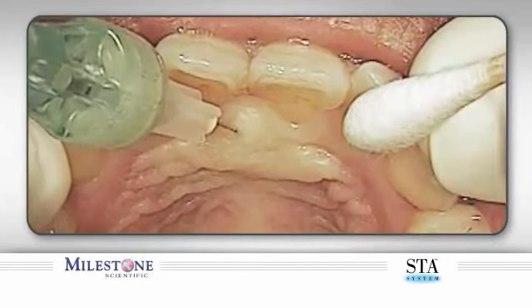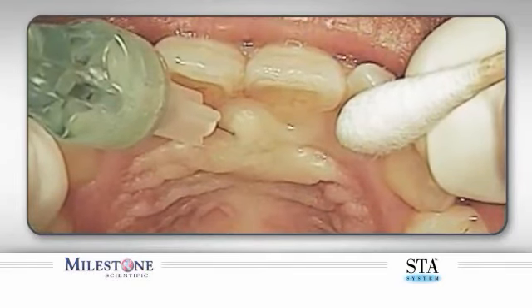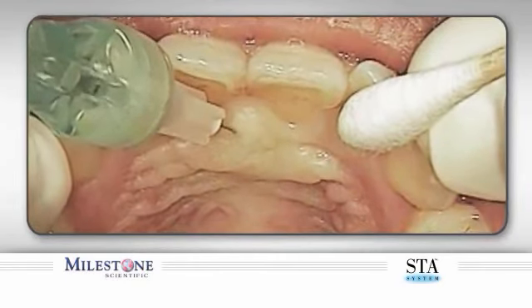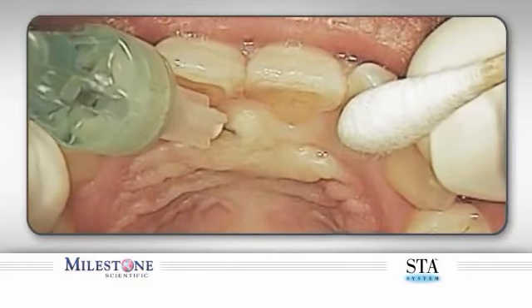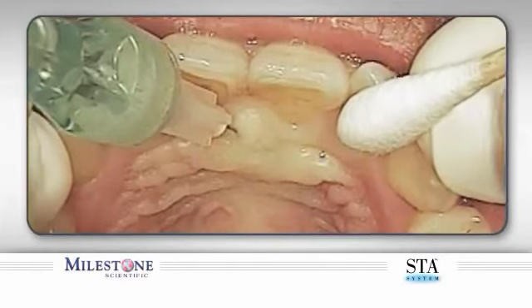If aspiration is negative, maintain position and deliver the proper amount of anesthetic. As the anesthetic solution is delivered, you will notice distinct blanching of the tissue. To avoid anesthetic sprayback during needle removal, use the following removal technique.